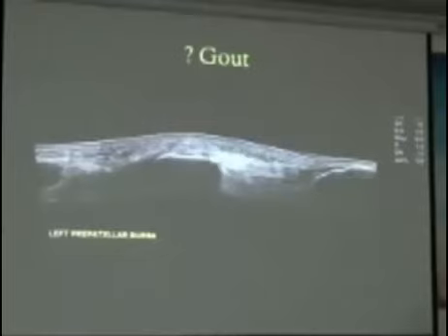But overnight he experienced extreme pain over the prepatellar bursa. So he was presented to us for an injection into the prepatellar bursa just for symptom control. But as you can see, there's quite a bit of edema within the prepatellar bursa, but there's no discrete fluid collections there.